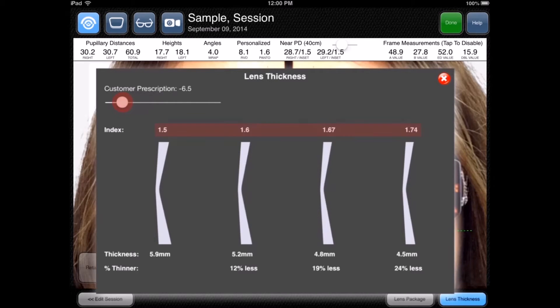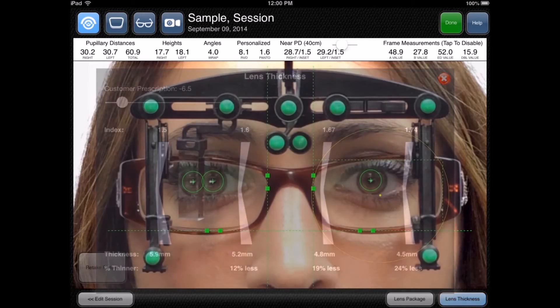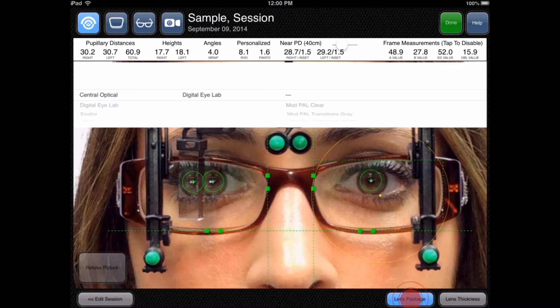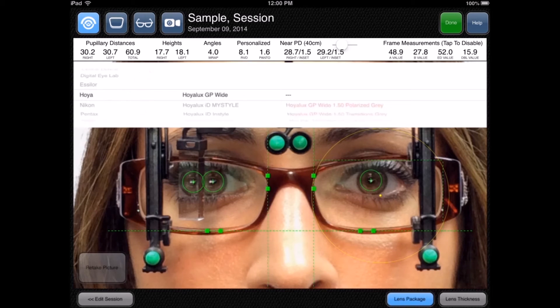1.67 and 1.74 lens using the patient's pupillary distance measurements and their frame measurements. You can also touch the lens package button to verify whether the chosen lens package respects the minimum fitting height and whether the lens cuts out correctly.